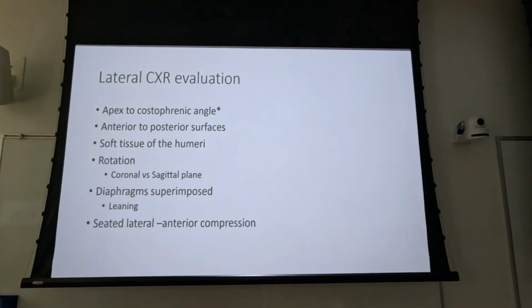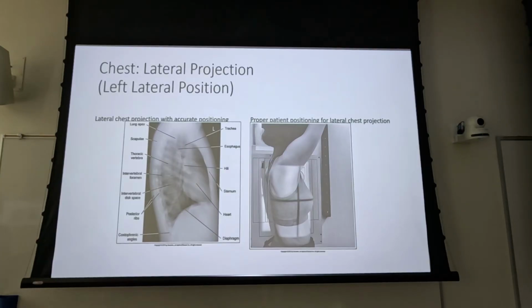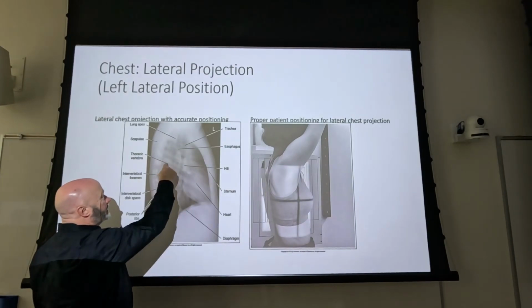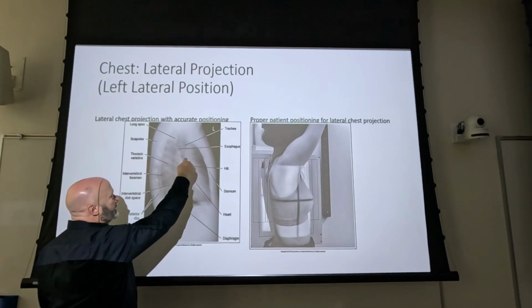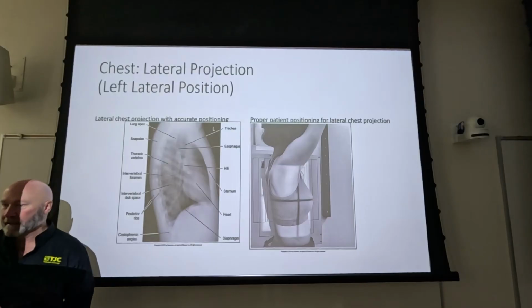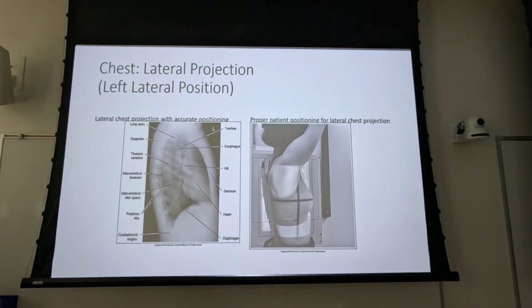Also, thinking about the lobes of the lung: you've got three in the right, two in the left. And the fissures between them aren't horizontal, so it's difficult to tell exactly where something is just on PA chest X-ray. Something that appears to be in the upper lobe might actually be in the middle lobe, because the fissures don't go straight across, but kind of diagonally like that. If we've got a lesion right here, is it in the anterior part of the upper lobe, or the posterior part of the middle lobe? We just can't tell on PA. So we get that three-dimensional perspective with the lateral.